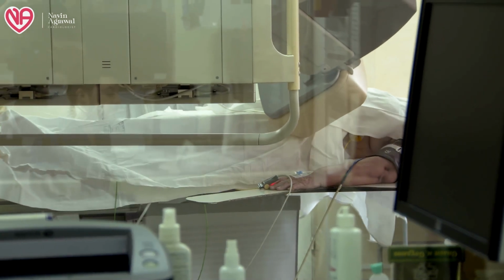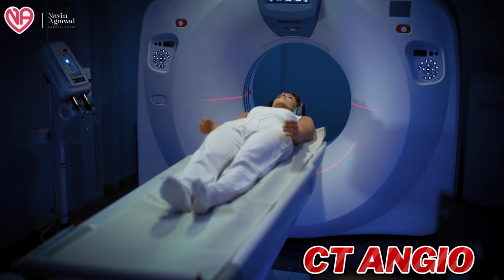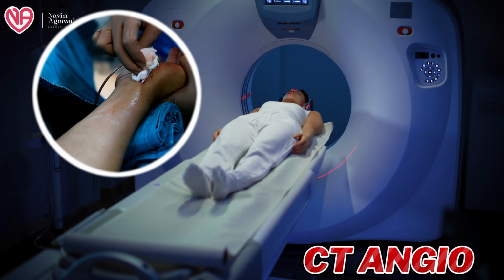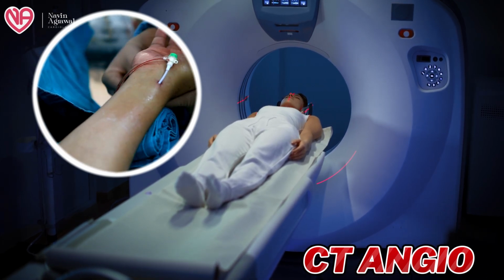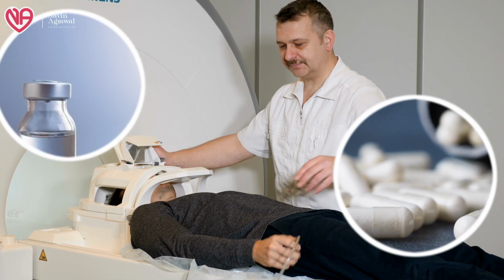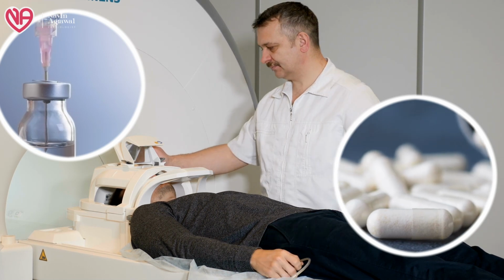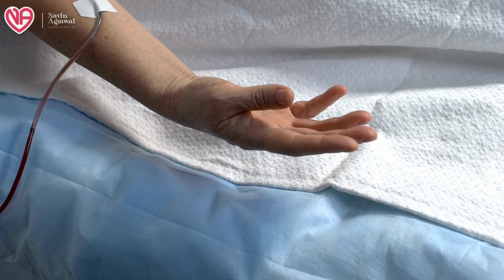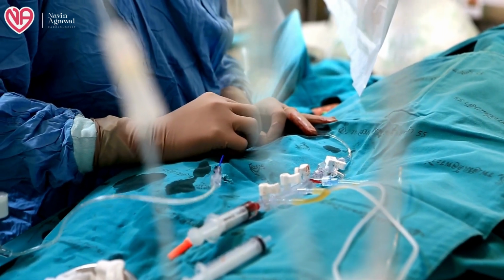In CT coronary angio, the concept is almost similar, but there are a few differences. In CT coronary angio, we do not take an arterial puncture, we do not go through the hand or leg arteries. Rather we do a venous angiogram, similar to the venous cannula that is put in to inject saline and other injectable medicines. The same venous cannula is inserted in the vein of the patient, and using that vein we use a power injector to forcibly inject the same iodinated contrast, which is almost similar to the contrast used in conventional catheter angio.